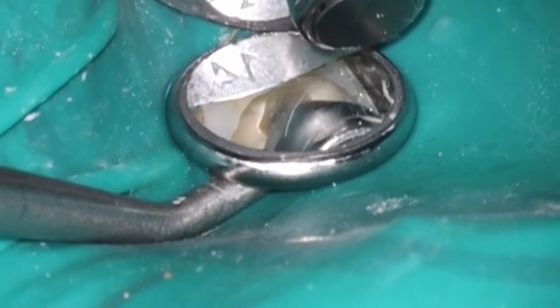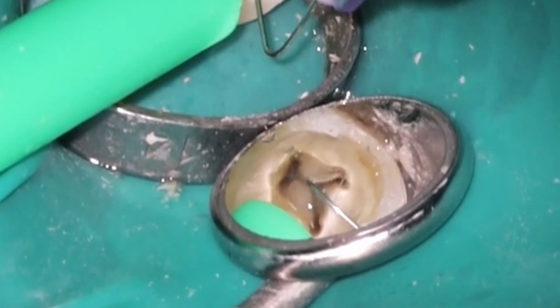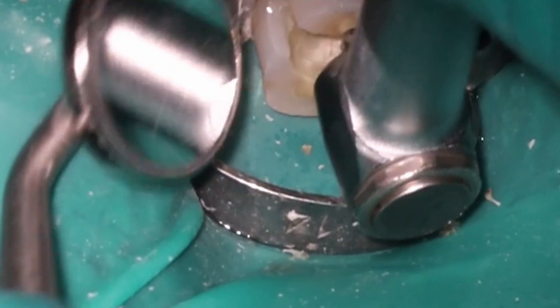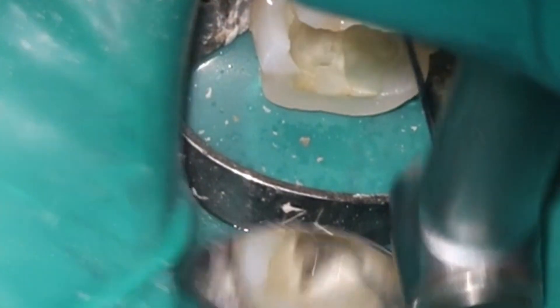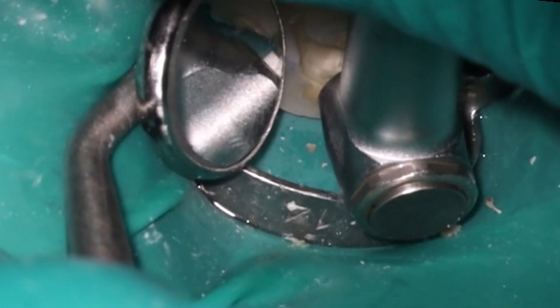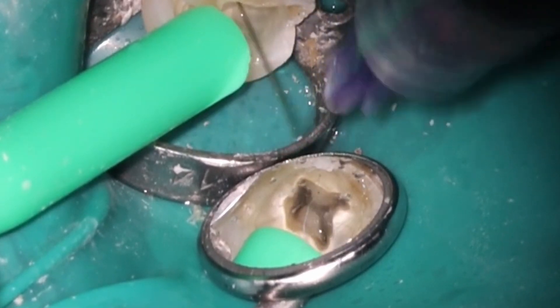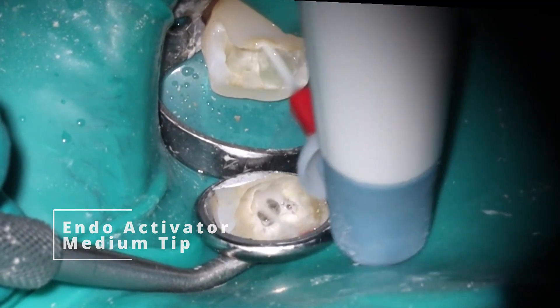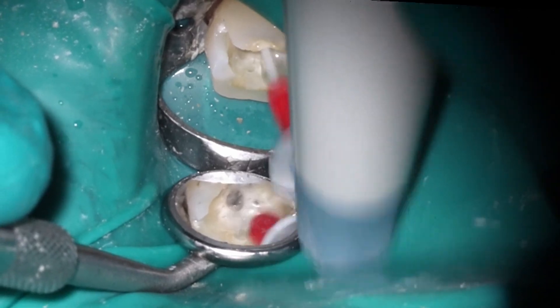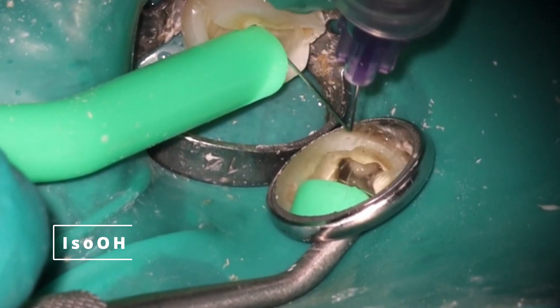Getting down here, you can see there's still some gunk coming up. But when we go ahead and do our rinse — lots more rinsing than we would normally, just because of how nasty this case was — it's starting to get pretty darn clean. You can see me using it right there going down to that color bar — that's my 22-millimeter mark. Each file system is different: sometimes they'll be longer, sometimes shorter. Pro Tapers are a little bit longer, for example. And the hubs that go into the handpiece vary in length too, which sometimes helps or hurts access. Going in with the activator — you can actually bend the tips to get them into that area.